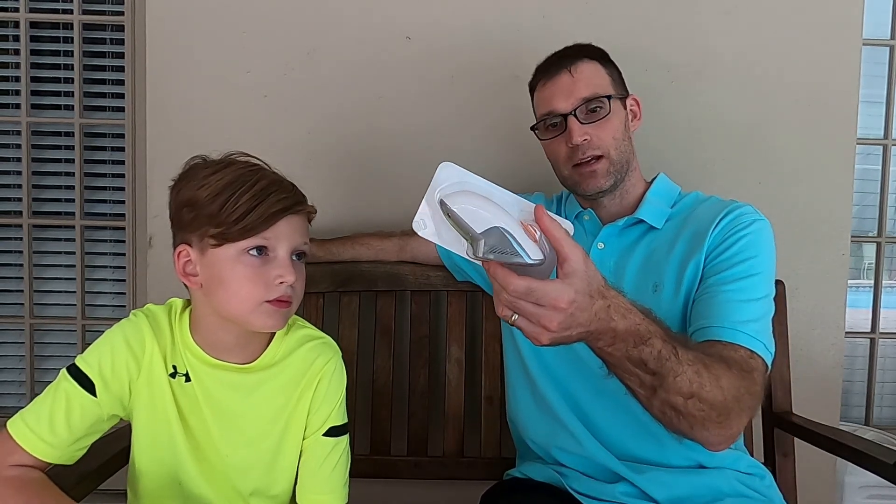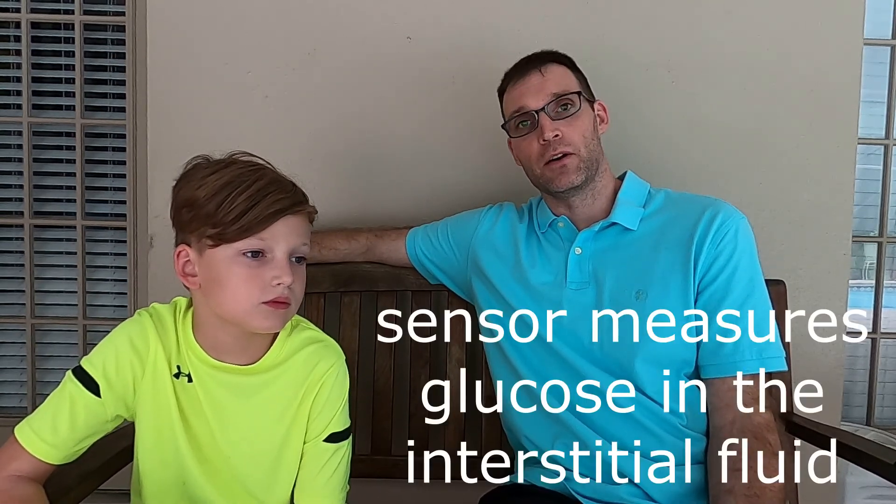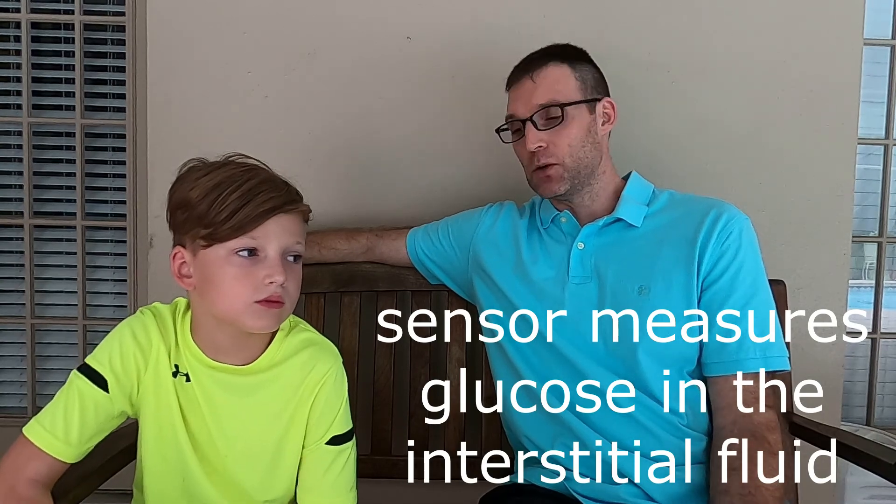What are you looking at right there? My blood sugar. Your blood sugar? So let's talk about how that works. We have the Dexcom G6 — it is the CGM, or Continuous Glucose Monitor, that we have, and we've enjoyed it. Basically how it works is we get an applicator — it looks like this — and one of these is used to put a sensor that goes underneath the skin in the interstitial fluid. And it measures the blood glucose underneath the skin. It goes in right now.